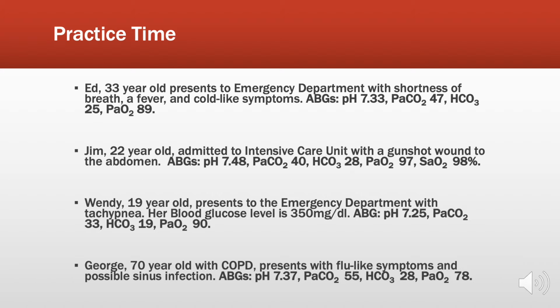The CO2 is high. We would give that an upgoing arrow. And the bicarb is on the high side, and we would give that an upgoing arrow. So how do we compare this? Do we say that the pH is normal and just forget about it and compare the other 2 arrows? The answer is no. You always have to compare the pH to something. So what we would do in this instance is we'd remember our normal value for pH is 7.35 to 7.45, and we think, does this pH look closer to abnormal on the low side or closer to abnormal on the high side?